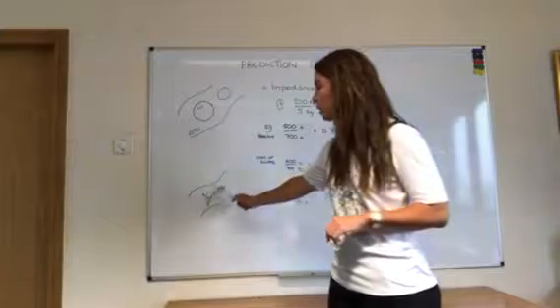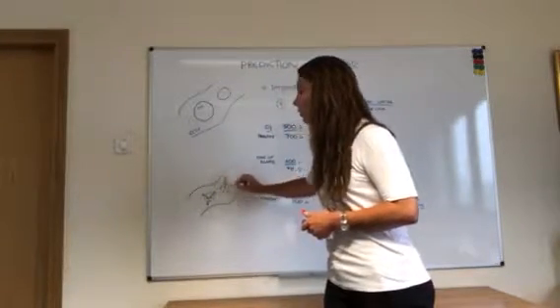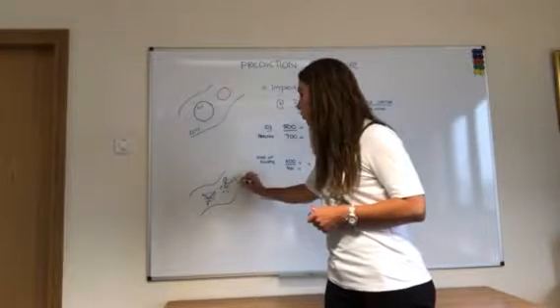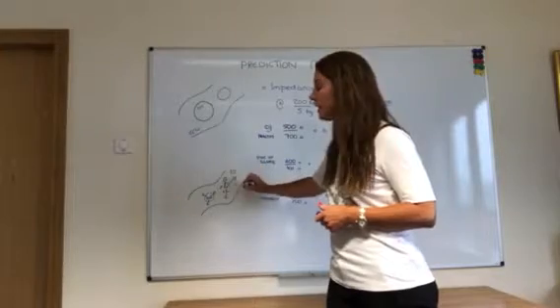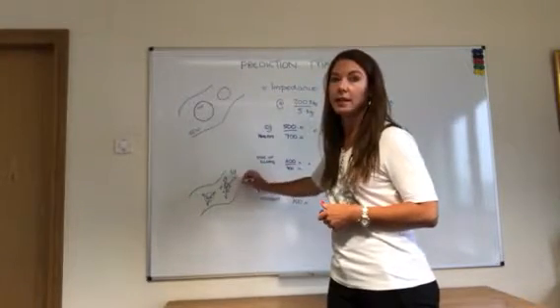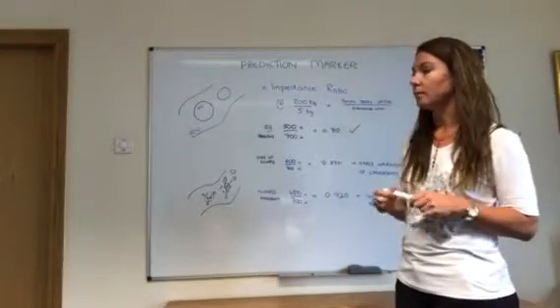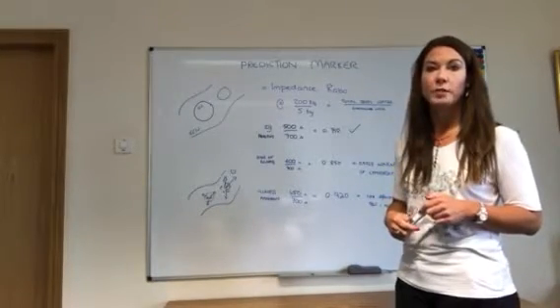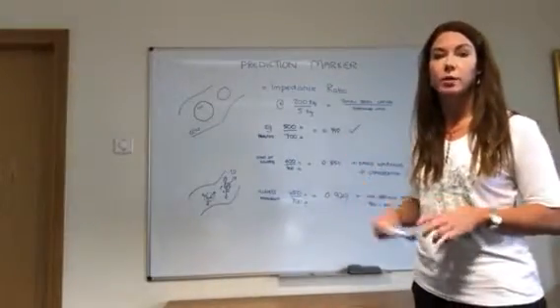So in this diagram, all the cell membranes are degrading and the water is escaping. So the difference between the extracellular space and the intracellular space is pretty much the same, which is a serious case and one to monitor. I hope this helps to explain a bit more about how the prediction marker works.